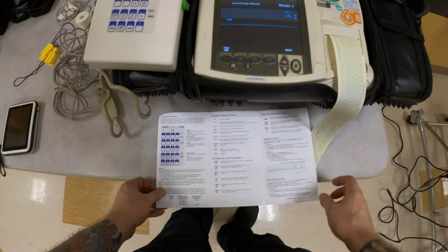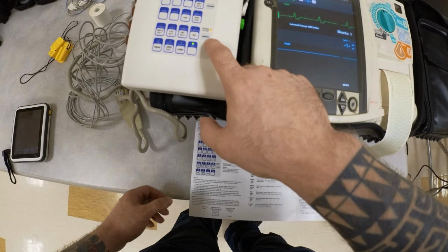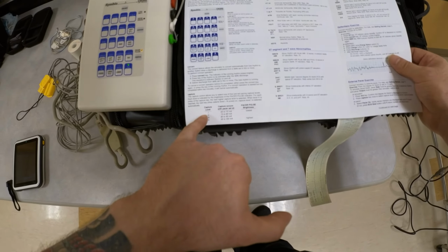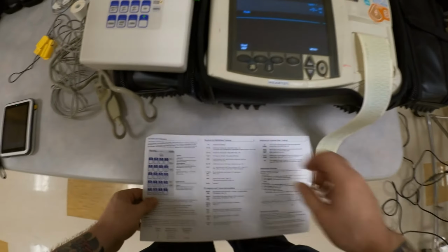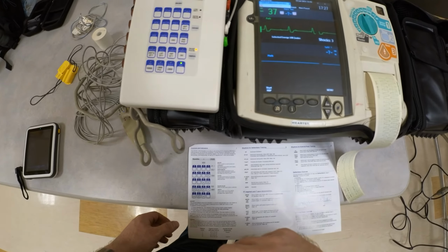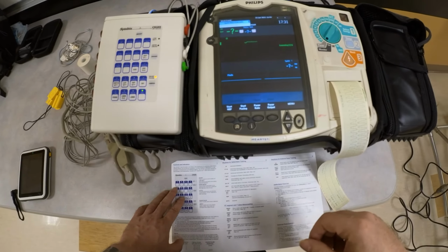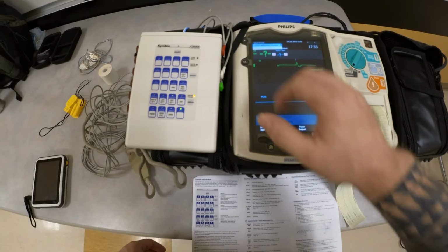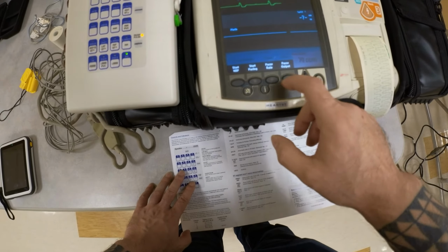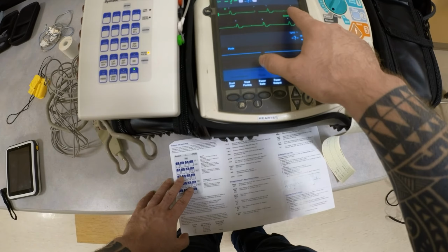So how will this work? You have a 3rd-degree heart block, and let me click it once, so it goes to level 2. One click, level 2, 75 to 80. So I click capture once. You notice this became brighter. Then I'm going to go ahead and engage my pacer. I usually tell the students you want to be at a rate of 20 to 30 above the inherent heart rate. So here, let's set our pacer rate to 70 beats per minute. I'm going to see that it's flagging my rhythm.